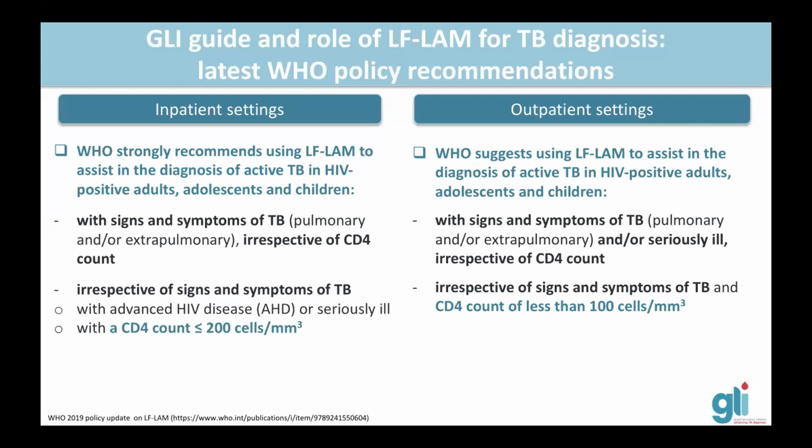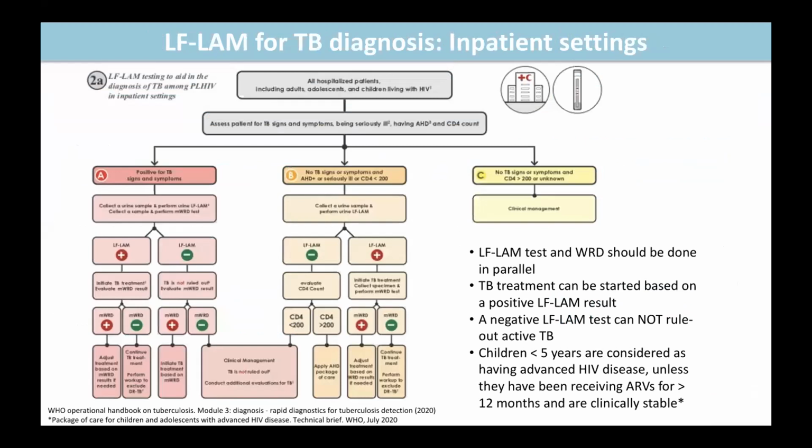When it comes to the outpatient settings, WHO recommends the use of lateral-flow LAM for assisting in the diagnosis of active TB disease in patients that present with signs and symptoms of TB and are seriously ill, irrespective of CD4 count, or irrespective of signs and symptoms if the patients have a CD4 count of less than 100.